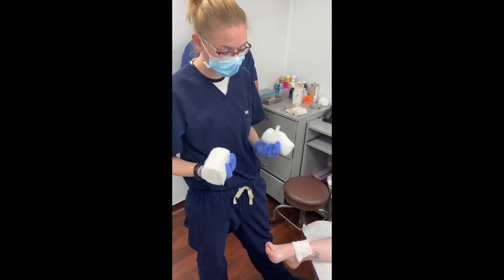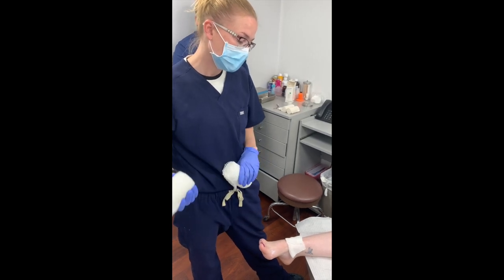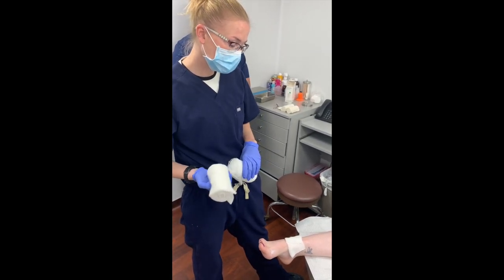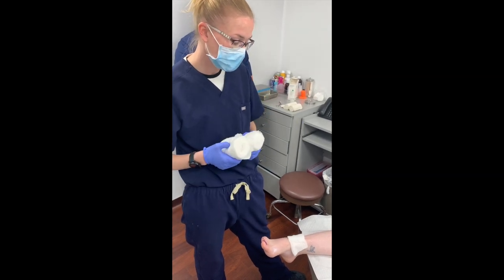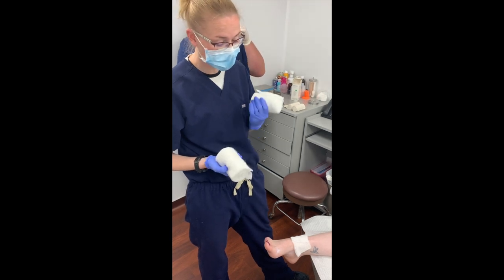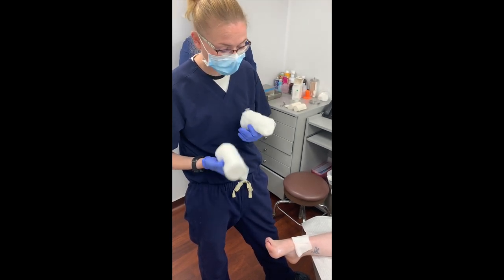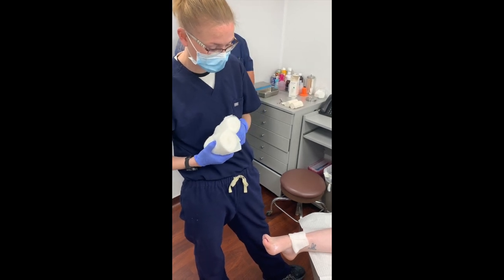Some people need that extra level of compression. Some people can't tolerate the ace compression or the co-band, or they're heavy exudators and the co-band doesn't breathe enough. Or they can't tolerate unna boot because their skin's too friable or too delicate, and you don't want to risk worsening things with the unna boot if you don't have the appropriate technique.